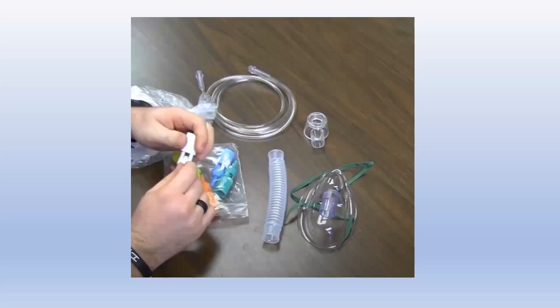Okay, so there's a question here by Maria. Can we give high concentrations of oxygen without doctor's orders? It depends on your facility. Oxygen is a drug, so basically it needs a physician's order. For people that work in critical care, we usually have standing orders, and you are covered to change the delivery system of a patient, depending again on the policy and the standing order of your facility. So in most ICU settings that I have worked at, the nurse has the freedom to choose the amount and the delivery system as appropriate, but that's based on standing physician's orders, okay? All right, Eunice, thank you. Sure, Maria.